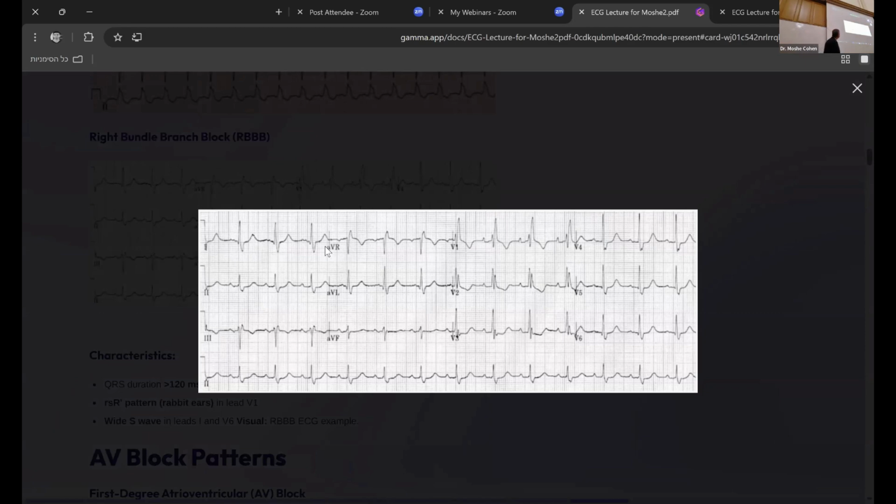Around. Let's choose this. Okay, we can start with here because it's on the line basically. So 300, 150, 100, 75. So it's around 80. Heart rate is around 80, which is okay. It's within normal limit. It's not tachycardia, right?